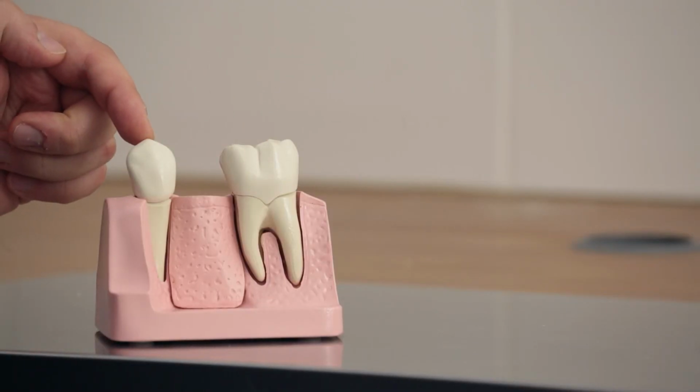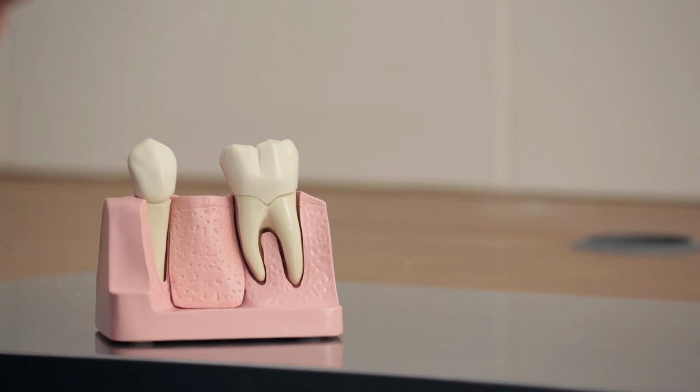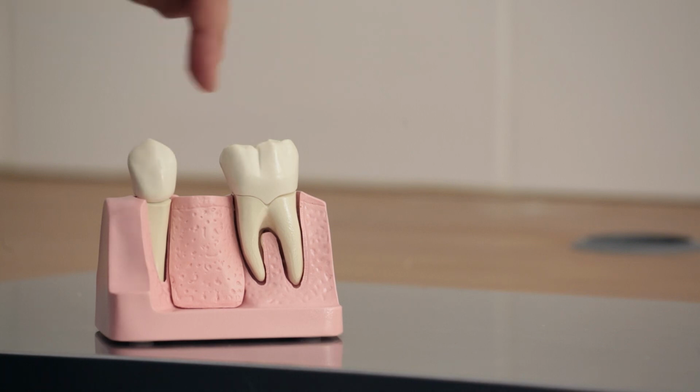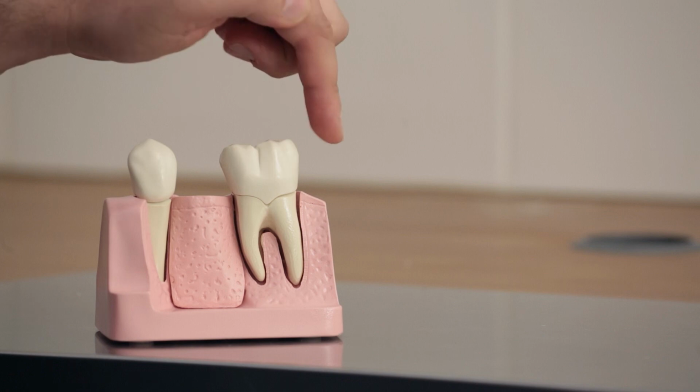In this example, we've got a molar tooth and a premolar tooth adjacent to the space, and usually your dentist will prepare the adjacent teeth for a crown or bridge preparation. That preparation usually requires a uniform thickness of tooth material to be removed both on the tooth behind and the tooth in front.